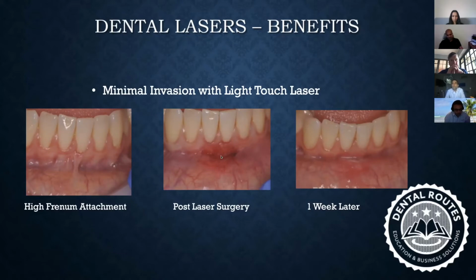It took me probably about 20-25 minutes to take out the frenum with my all tissue light touch laser. This photo is as soon as I did it. Okay, you can see there is no bleeding. It's completely healed. In a way, the area itself looks nicer. And then that's how the patient went back home. There are no sutures as well.